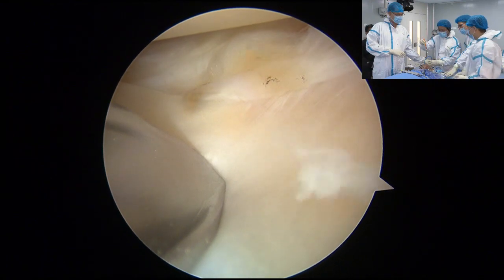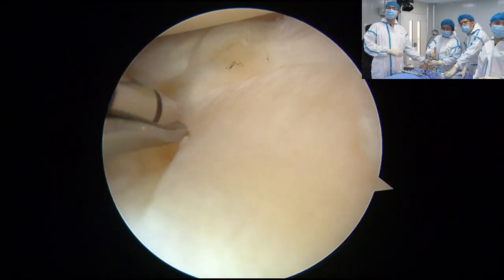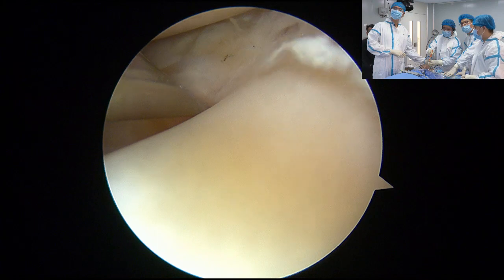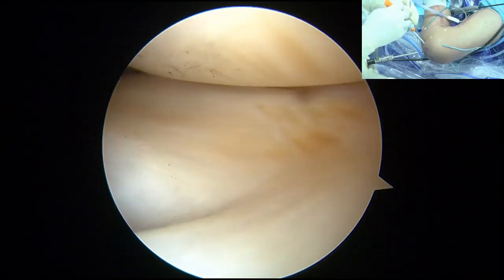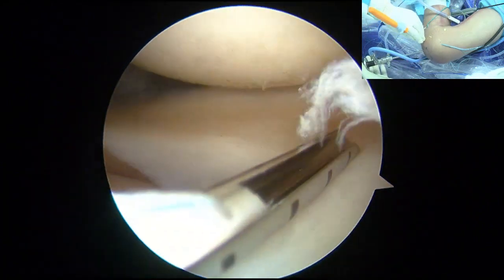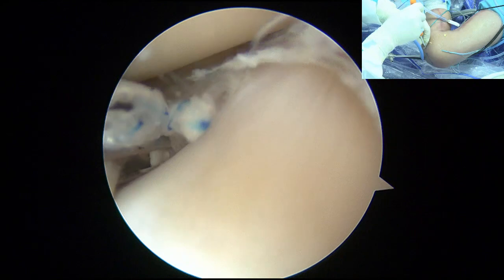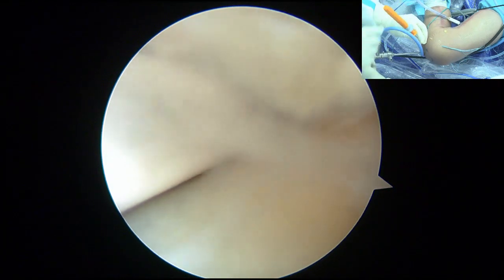So use your half pipe or the slot cannula like your retractor. You can retract a little bit, okay? And the way to go in, you need to go like this, okay? Slide it. 这个滑板的作用呢就像是个拉钩，然后 fast fix 进去的时候呢尖端朝下。Okay, move a little bit. 有滑板保护。Then I will catch the capsule. 进去之后呢是先穿到关节囊。Here. Okay, here. We try to make it a vertical mattress, okay? 我们准备做个垂直入式缝合。From here, because this area is safe, right? Go this way, okay? And then you push, 然后推 right?